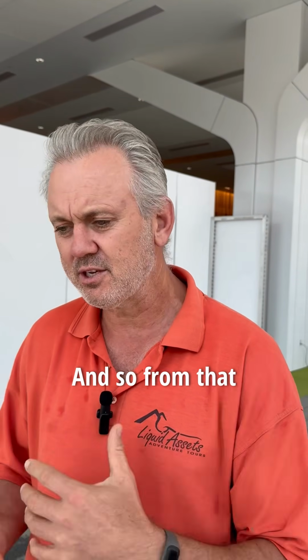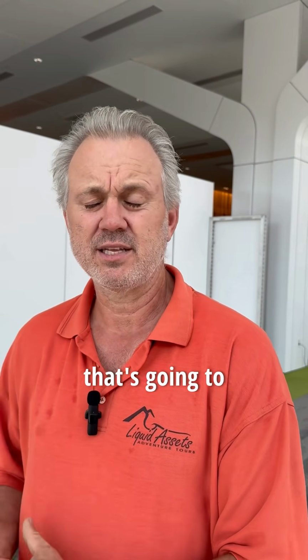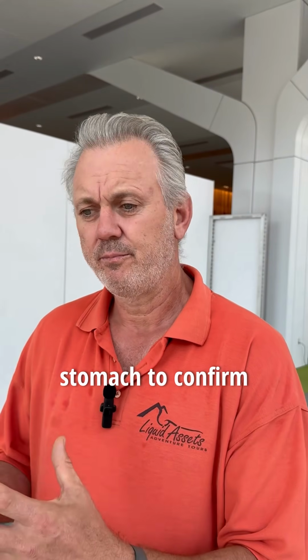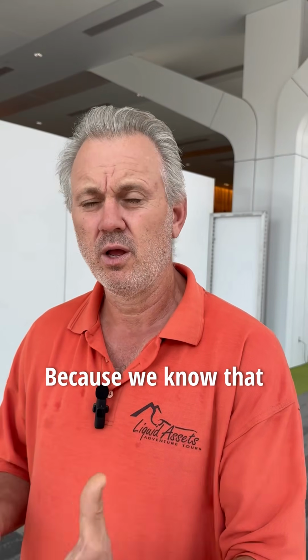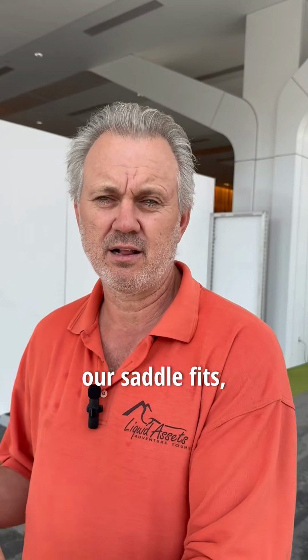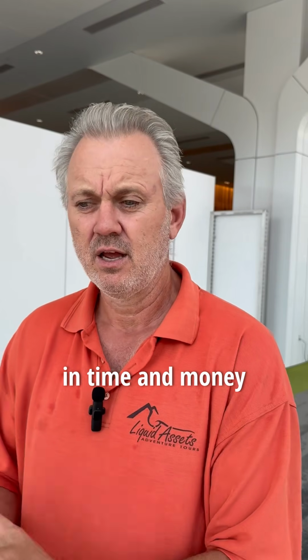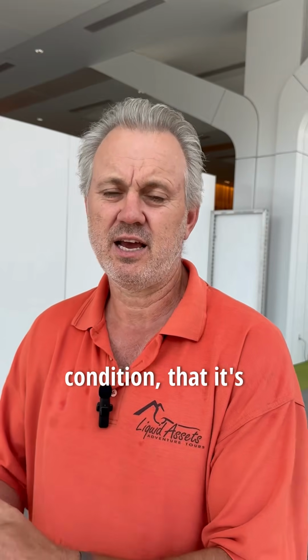From that point, when we recognize those behavioral changes, it's really important that we pin down an accurate diagnosis. Most commonly, that's going to involve gastroscopy and looking inside the horse's stomach to confirm, first of all, that gastric ulcers are there, because we know that musculoskeletal disease and saddle fit issues can mimic exactly the same behavior presentations. So we want to make sure, before we invest time, money and resources into treating the condition, that it's actually there.